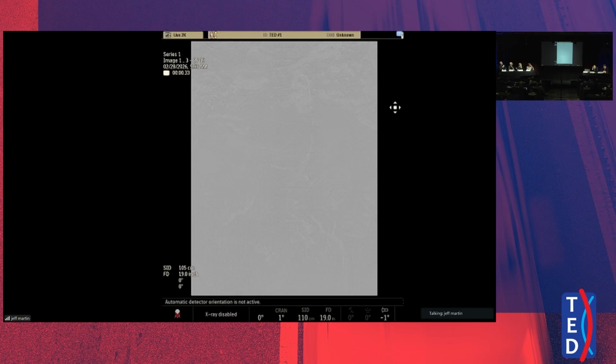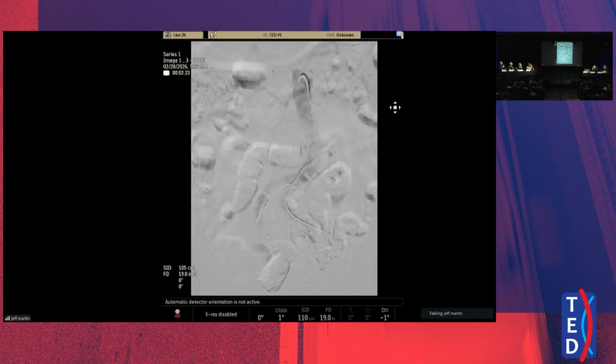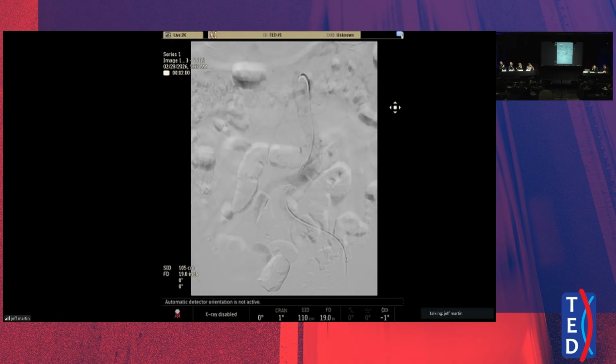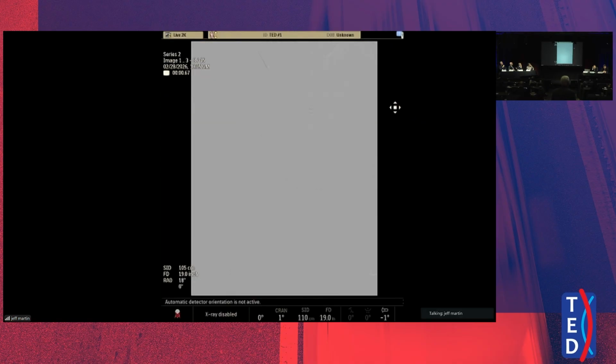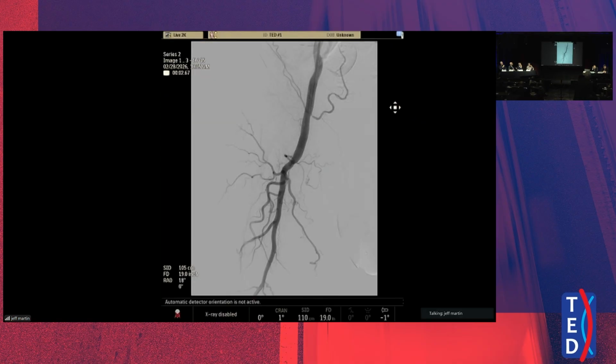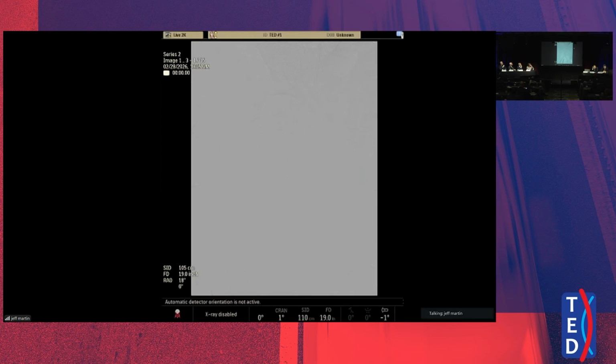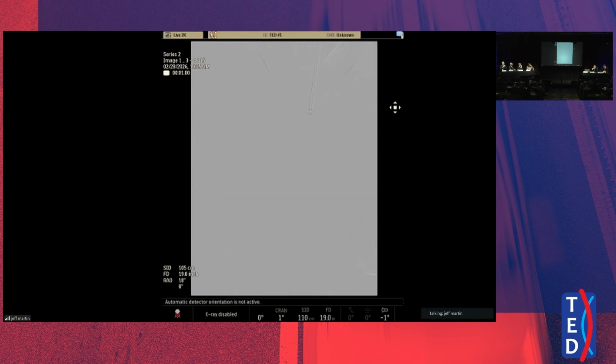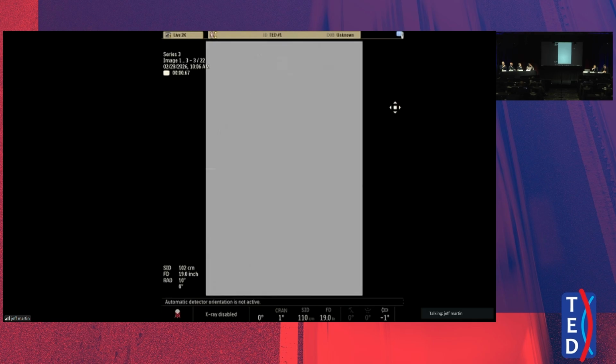You can see the iliac bifurcation is extremely important when you do these cases, especially if you go up and over. The second thing is he had a flush occlusion, so you don't even see the takeoff of the SFA. And we struggled quite a bit because of the acute aortoiliac bifurcation to try to poke into that nipple. And after a while, I just gave up. So what we then did was we basically punctured the SFA and went retrograde.